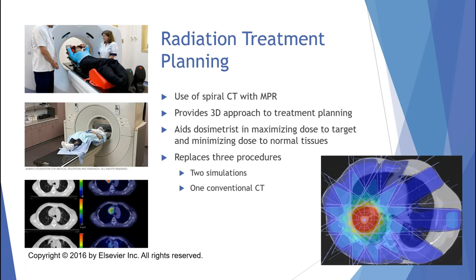And you can map those out. You can do 3D images for the radiologists that are doing the treatment. It aids the dosimetrist in maximizing the dose to just that target. It knows how deep they have to go. I mean, it is great, great stuff for patients that need these treatments.